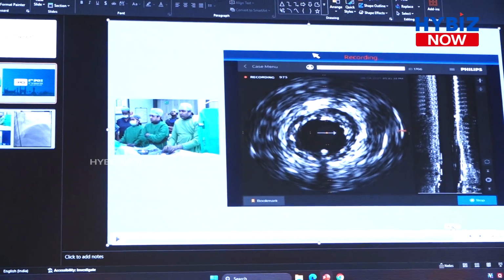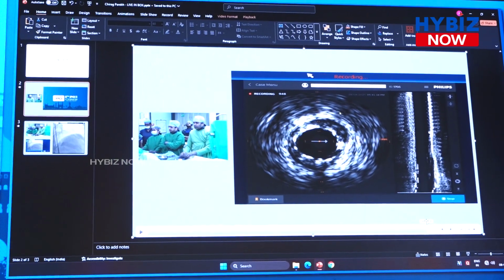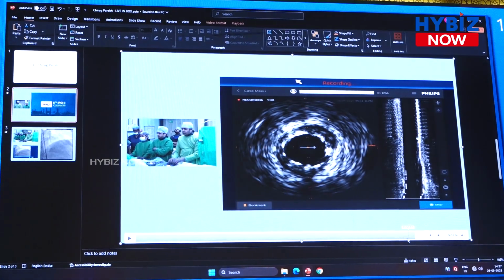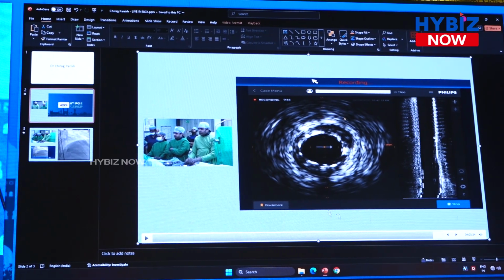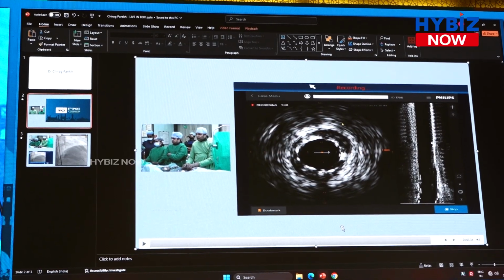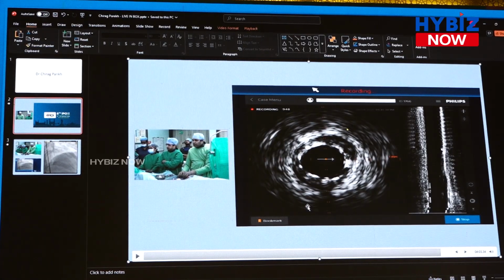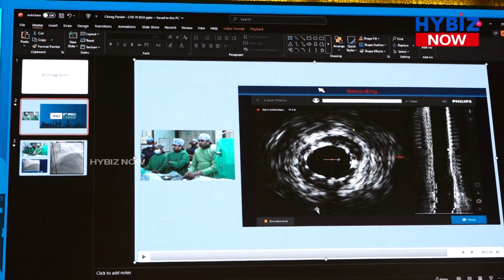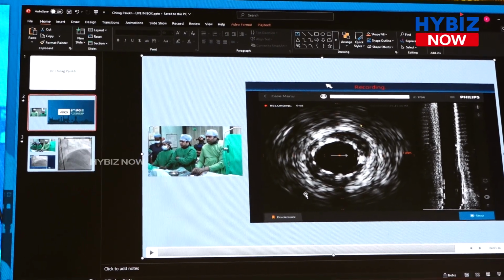And now this is the diagonal. You don't have the stent edge problem. It's inside the stent, it's distal. In those cases, you can modify the lesion, and DCB is a good option for those. We don't have systematic data available, though there is a class 1 recommendation for DES nowadays for ISR. But I think this science is evolving. You can go with a DCB rather than going for a second layer. What will Dr. Akasaka tell you?